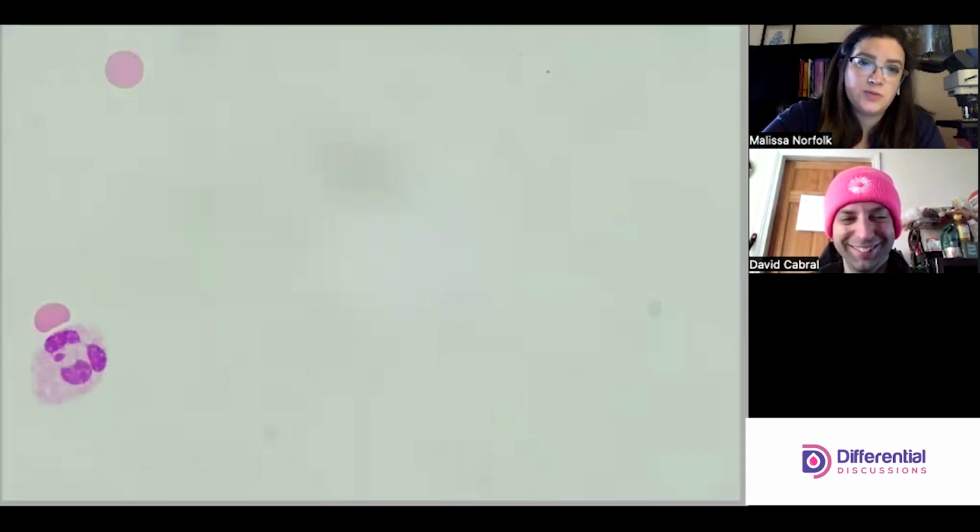Well, I think it's nice because we're just seeing normal cells. We didn't see anything alarming. Yes, interesting.